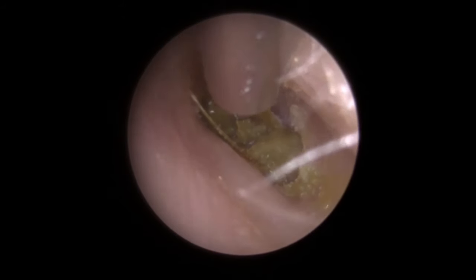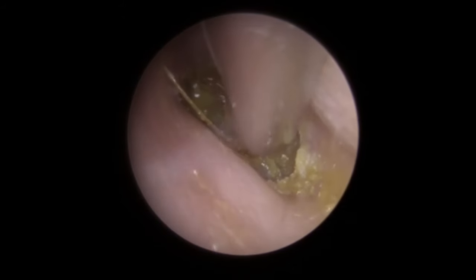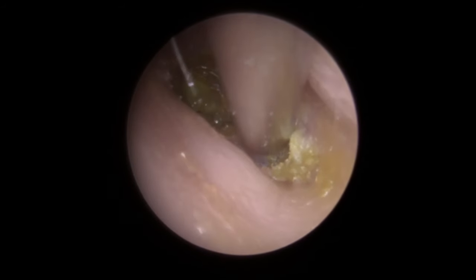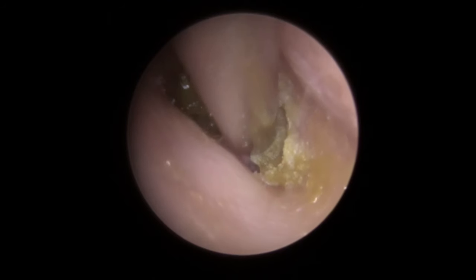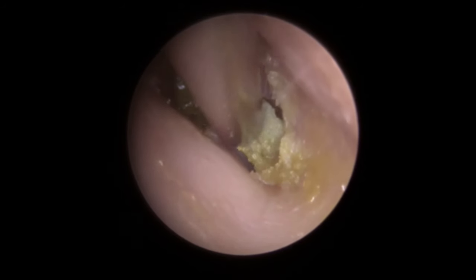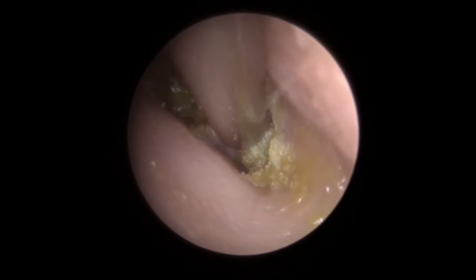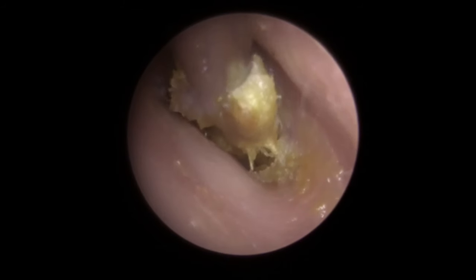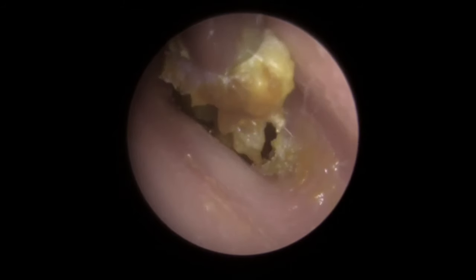At the moment we haven't got to the eardrum, so we don't know how well attached it is to the eardrum. So we're just going to very gently use the power of the suction, trying not to dig into this. A little bit complicated by the shape of the canal. There we are — I've got a little bit of traction to the base there. So just lift it — there we go. You can see a chunk of that skin come away. A lot of this, because it's small, got sucked straight inside the tank.